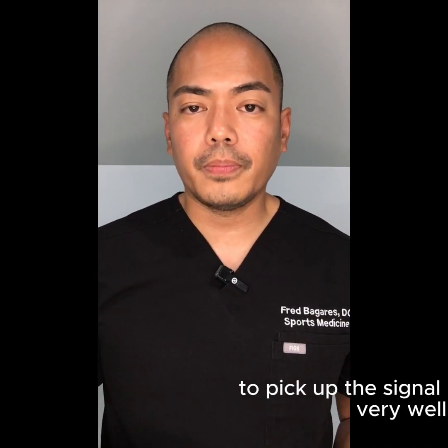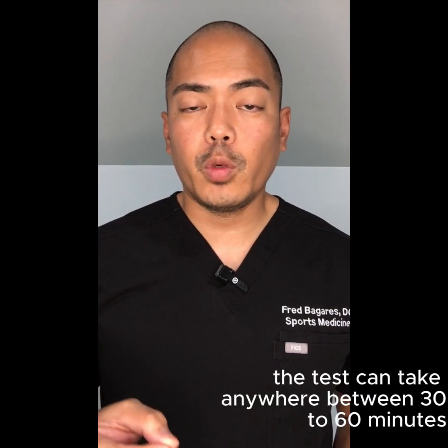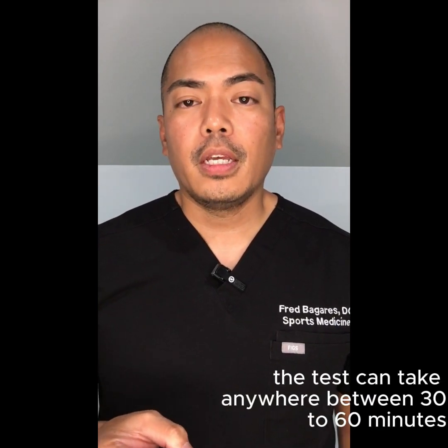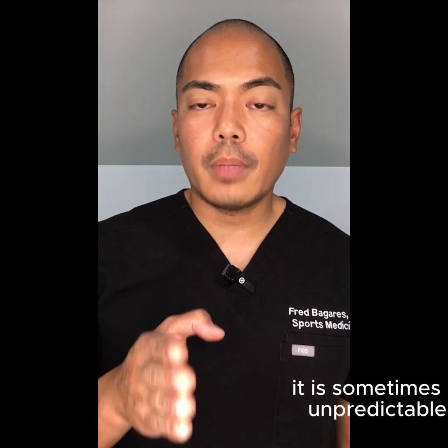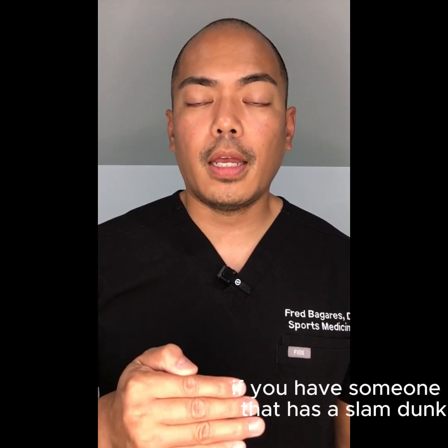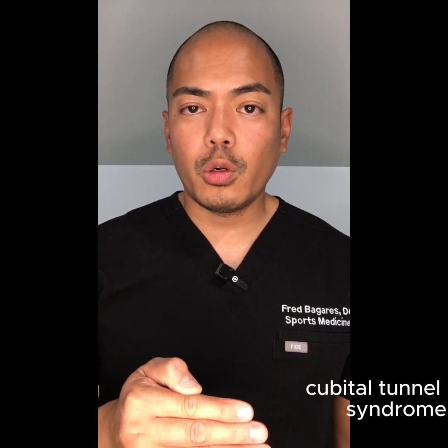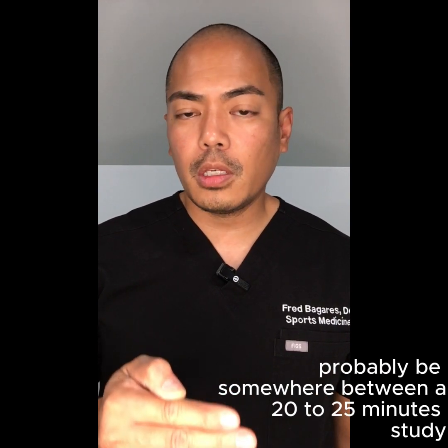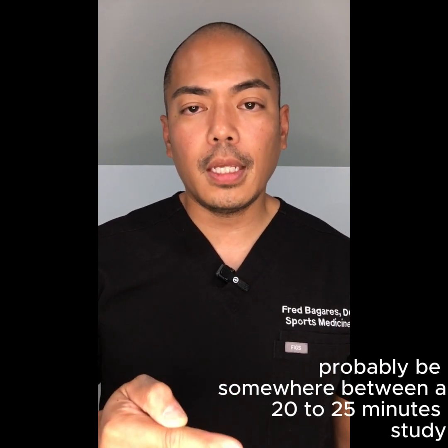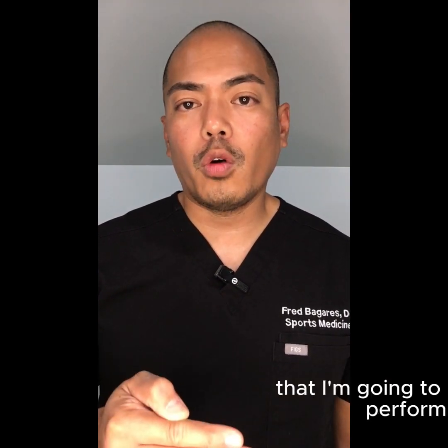The second thing is to inform your patient that the test can take anywhere between 30 to 60 minutes. So when I mean anywhere between 30 to 60 minutes, it is sometimes unpredictable. If you have someone that has a slam dunk carpal tunnel syndrome, cubital tunnel syndrome, I can pretty much guarantee that it will probably be somewhere between a 20 to 25 minute study, in addition to any history and physical that I'm going to perform.